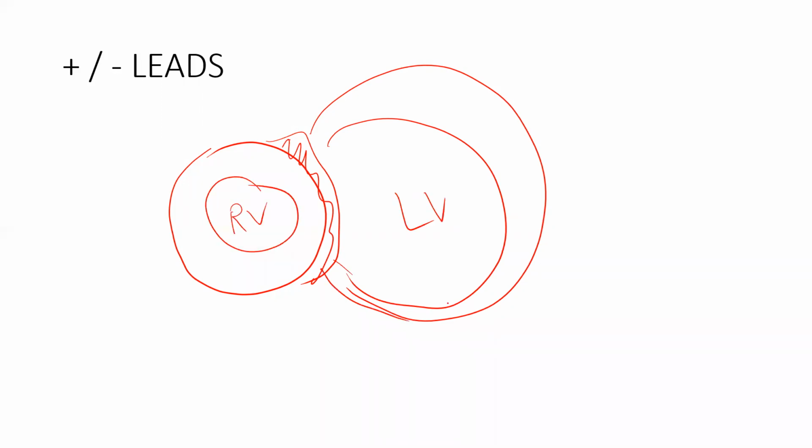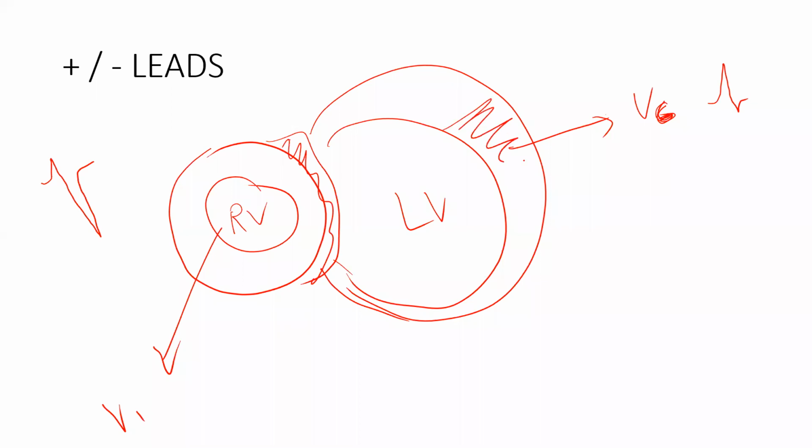Now what we told is, your V6 is showing all the activity of your positive wave in the left ventricle, okay? And we'll take this one as V1 here. So normally, how does it have to be formed? Normally this was the V1 waveform, and this was the V6 waveform which we had here. Okay, this was the normal waveform. Now this much of the myocardium is infarcted. This much is not contracting at all now. This is dead myocardium. Only this is working now.